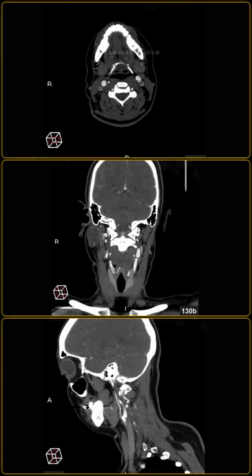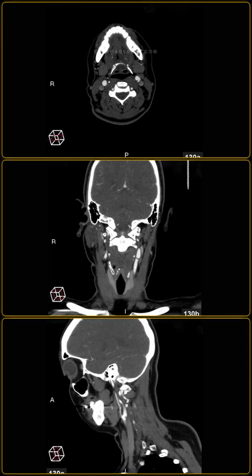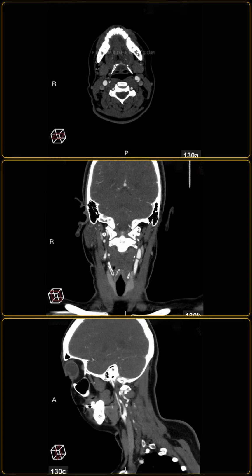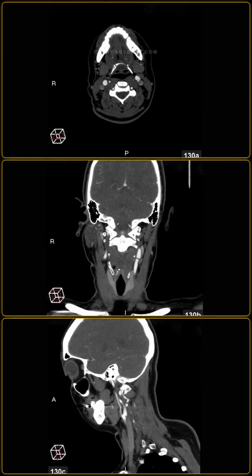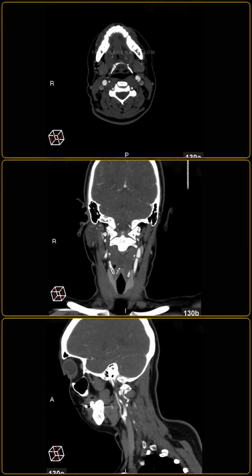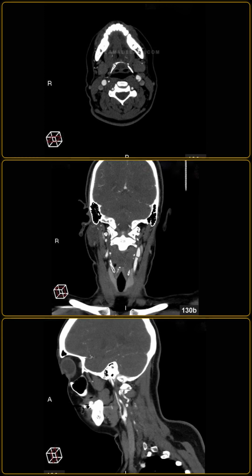Discuss the appropriate further investigations and therapeutic options for this patient and how you would manage them as a radiologist. Further imaging should include a brain MRI with diffusion-weighted imaging and FLAIR to define the vascular territory of any acute or chronic infarctions. Given the history of recurrent stroke, this patient is at high risk for further ischemic events and must be immediately referred to the stroke team.